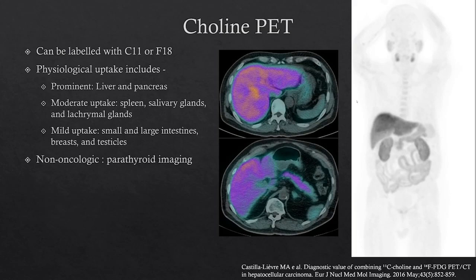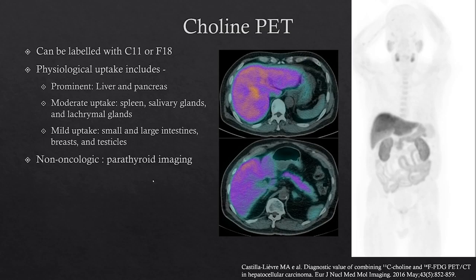Here are some images of choline PET. Choline can be labeled with either C11 or F18; these images are of F18-choline PET. Typical sites of prominent uptake include the liver and pancreas. Other sites of moderate uptake include the spleen, salivary glands, and lacrimal glands. You can also see mild uptake in the small and large intestines, breasts, and testicles. Choline PET is currently seeing increasing use not just for oncology but also for non-oncologic parathyroid imaging.